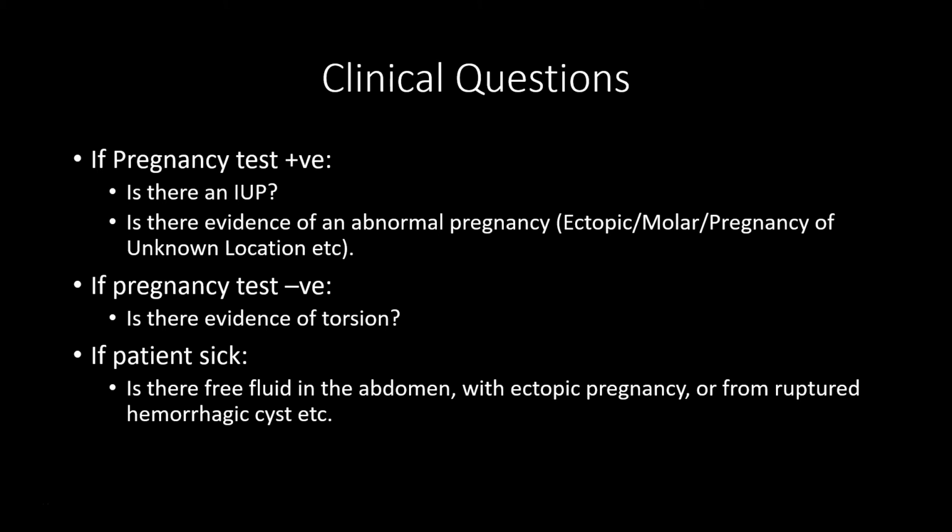but it is a thing that is helpful frequently. And then finally, if you have a sick appearing patient, it can be very helpful to do a quick bedside ultrasound for a young woman of childbearing age, if she's pregnant, to see whether or not there is free fluid in the belly based on that FAST exam that we talked about elsewhere. And at the same time, if they're not pregnant, to think about whether potentially there's a ruptured hemorrhagic cyst, which can make people pretty sick as well. There's a number of other pathologies that can present, but that's another way of thinking through that.